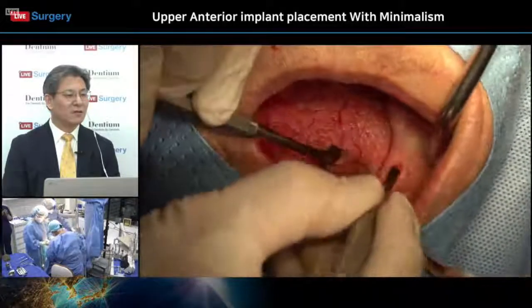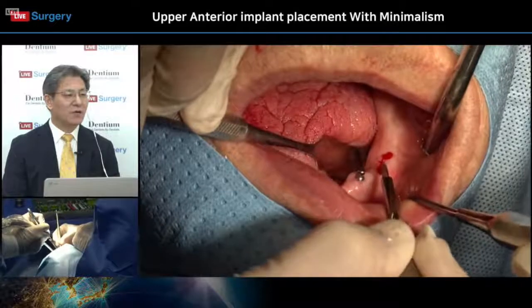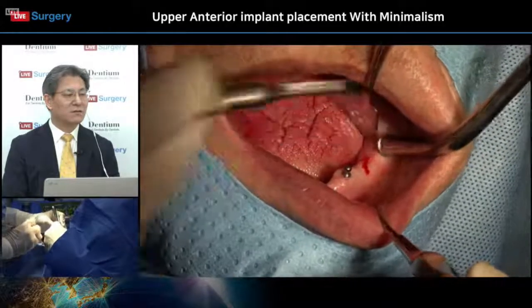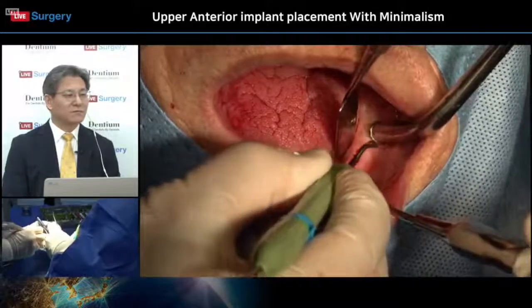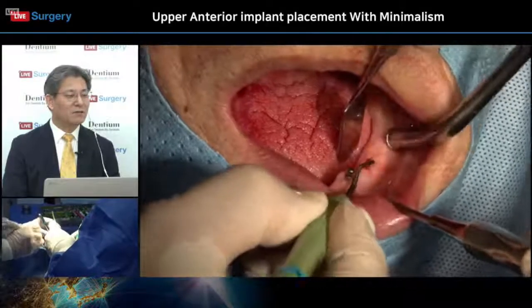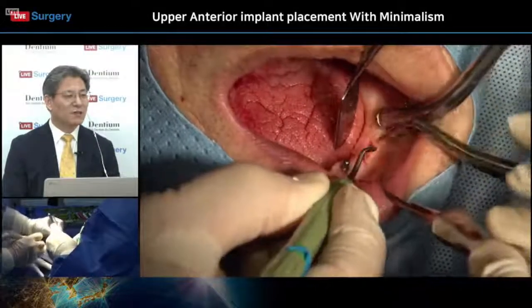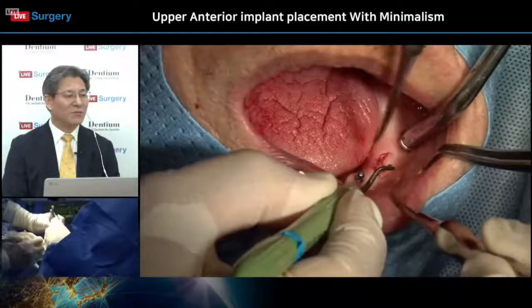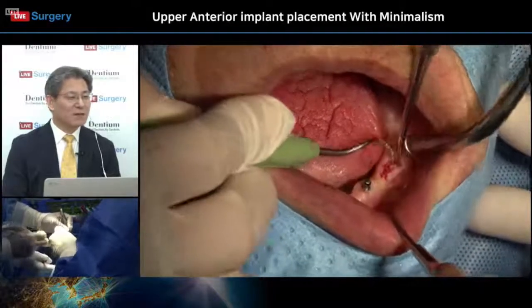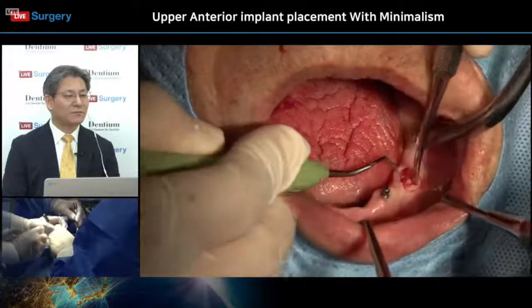I will try the bone checking. Okay, so with a bone incision, checking with a little bit more vertical incision. Yeah, he wants to check the bone width and bone quality. Now sometimes he is using the periodontal curette, it looks like. I think he is a periodontist, so the periodontal instrument is familiar to him. So he frequently uses a periodontal instrument instead of a big surgical curette or surgical instrument. So, flap reflection and checking the width. Bone is relatively good, so okay.